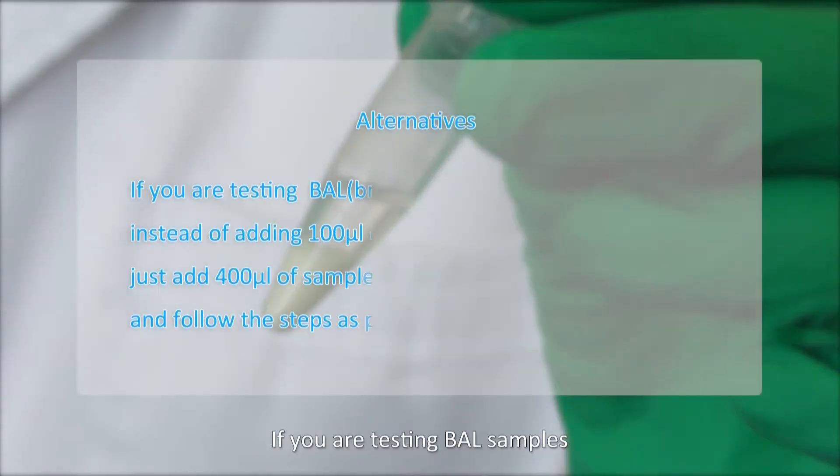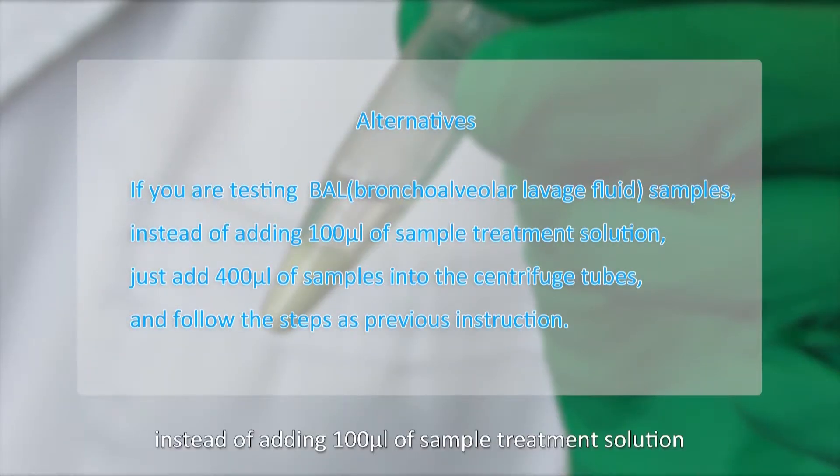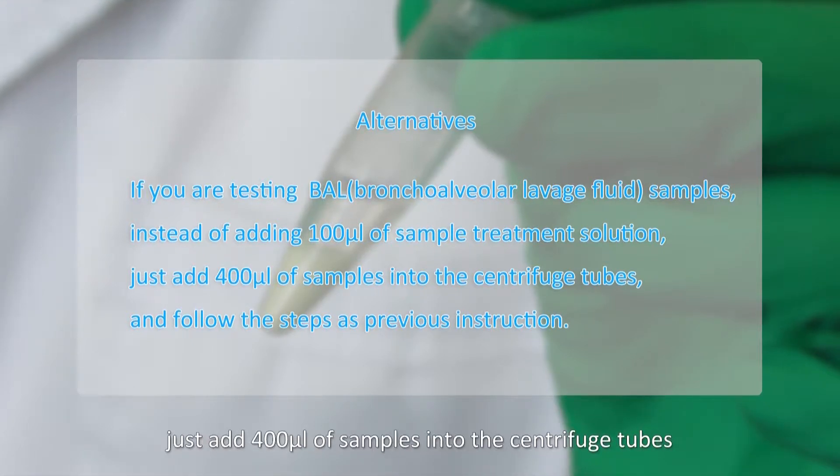If you are testing BAL samples, instead of adding 100 microliters of sample treatment solution, just add 400 microliters of samples into the centrifuge tubes and follow the steps as previous instruction.